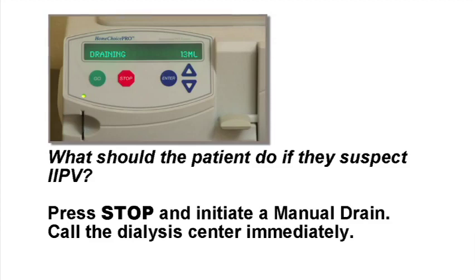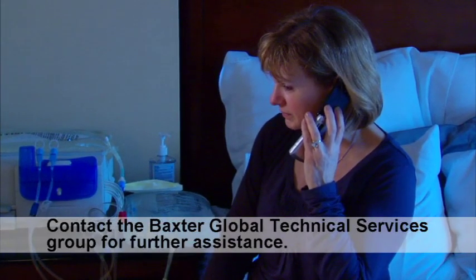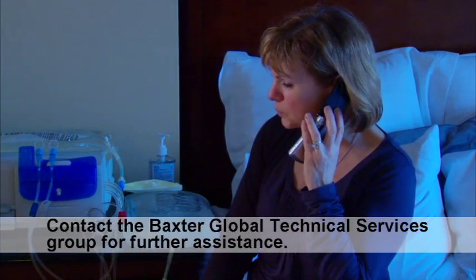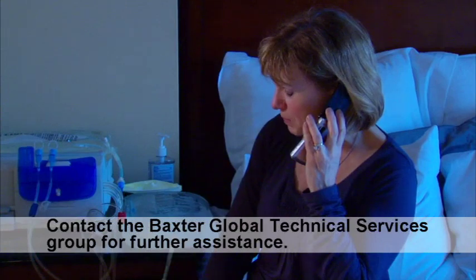Call the dialysis center. If the patient cannot reach their dialysis center and is experiencing symptoms of IIPV, they should call 911 immediately or go to the nearest emergency department. If you need further assistance, call the Baxter Global Technical Services Group, available 24 hours a day, 7 days a week, at 1-800-553-6898.